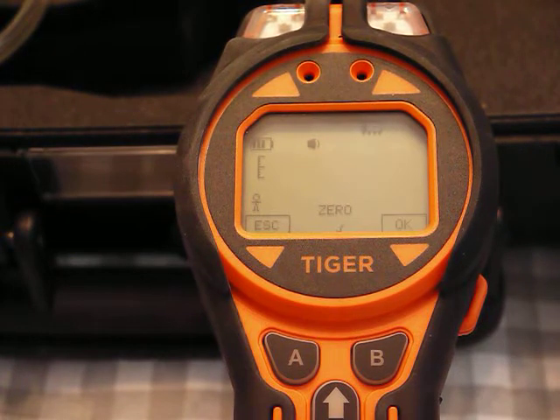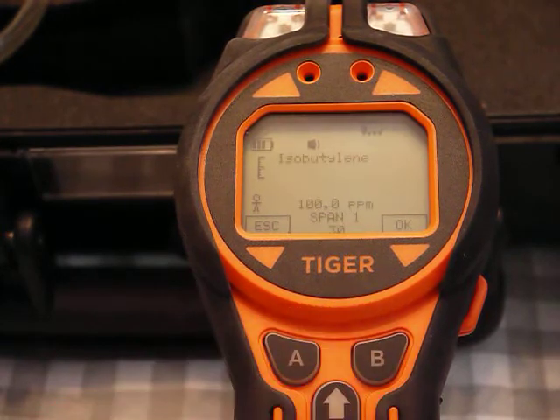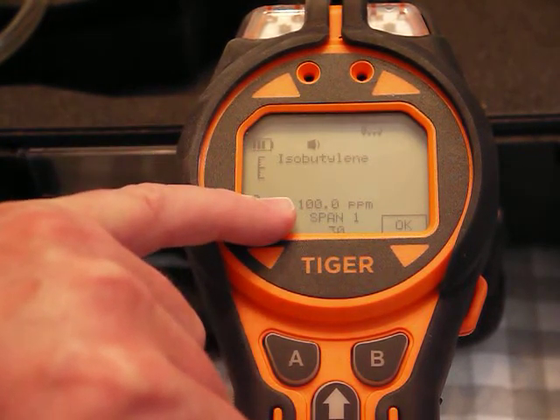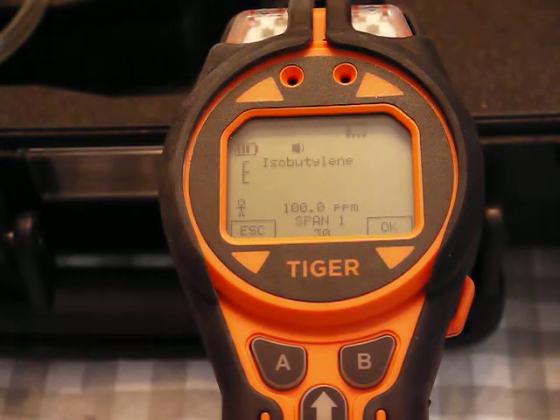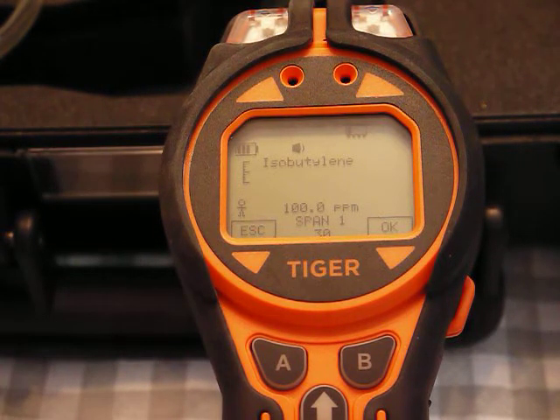When the zero is done there's a little check mark and an okay button. I click that — that's our zero. You can see now it's looking for 100 ppm as a span. Calibration consists of zeroing and spanning, just like pretty much any other instrument.